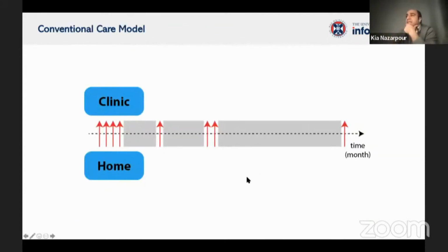So at the moment, when a limb loss happens, either through amputation, controlled amputation or otherwise, the person goes several times to a clinic, and they have to wait for a long time, and then they pay another visit and wait another long time. They receive a socket and a body-powered prosthesis before a myoelectric control, and then many months or years after that, they might go to the clinic one or two more times to fine-tune something.